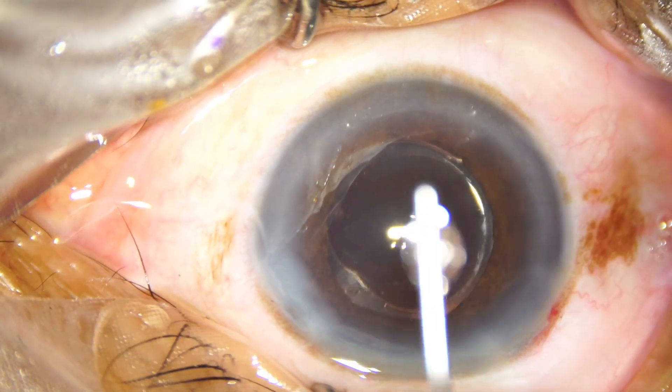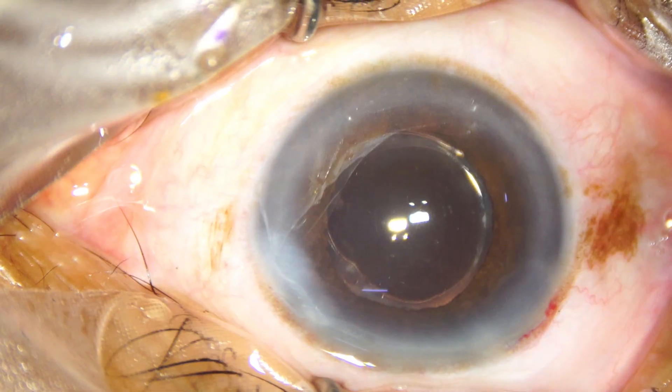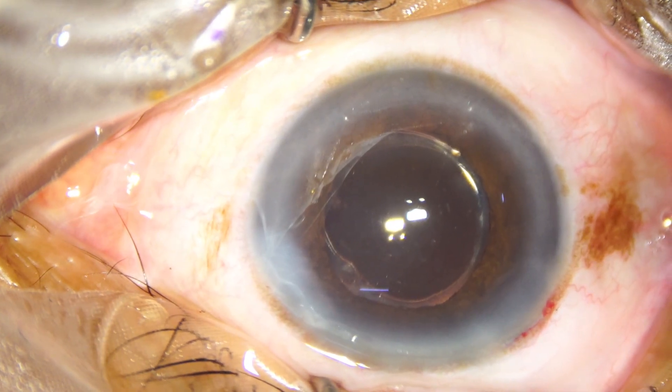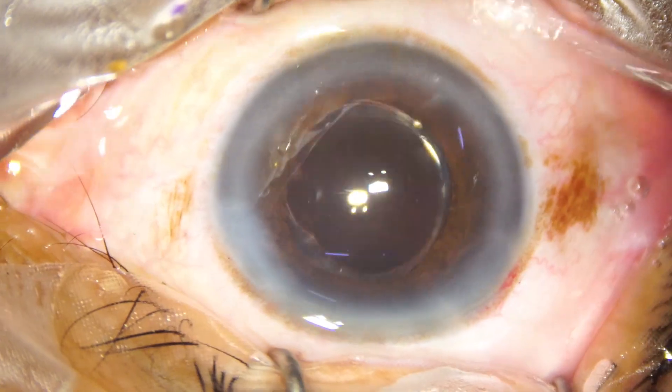Now we are towards the end of the surgery. The side port is closed by corneal stromal hydration, and after that, a thorough lavage of the anterior chamber is done.